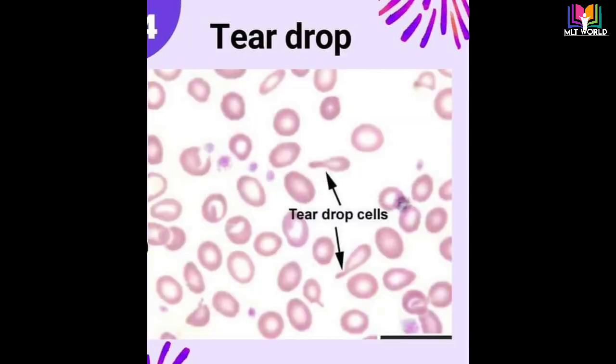Next is tear drop cells. As we can see, they are tear-shaped, that's why these cells are called tear drop cells. The presence of tear drop cells may indicate anemia caused by bone marrow not producing normal cells due to toxins or tumor cells, and cancer in the bone marrow. Myelofibrosis or severe iron deficiency anemia also indicates conditions where we will see tear drop cells in RBC morphology.